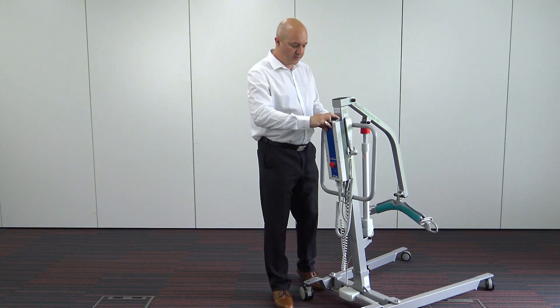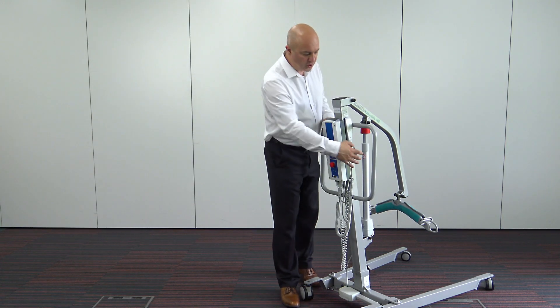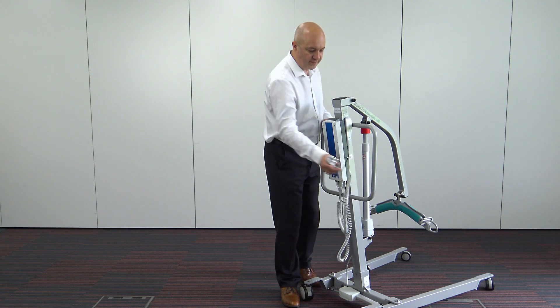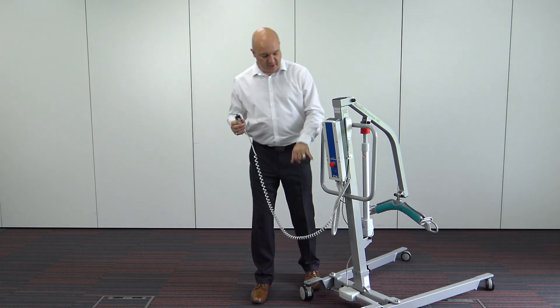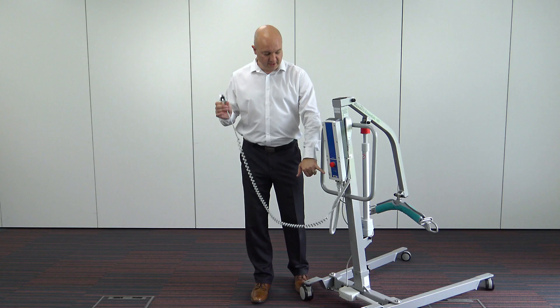Although most of our customers prefer onboard charging, which is done from a socket underneath the control box — it's plugged in directly to the wall, which will then give you a couple of lights. The first light says on, telling you there's power coming from the socket. The second light, which is orange, will light if it's actually receiving charge.